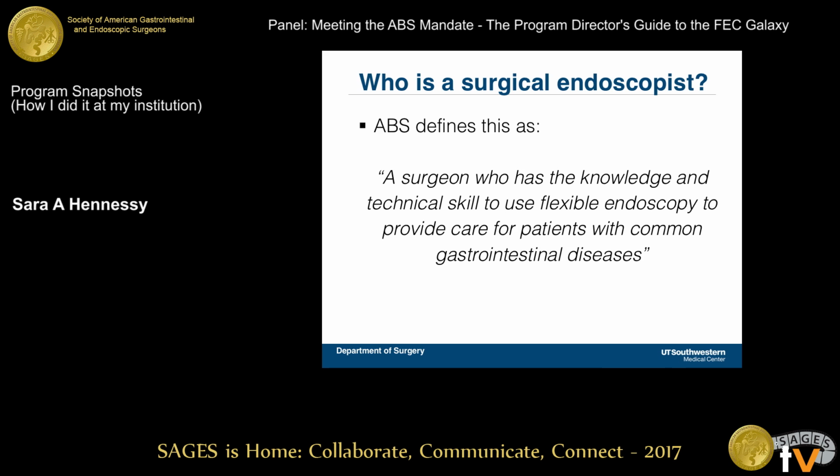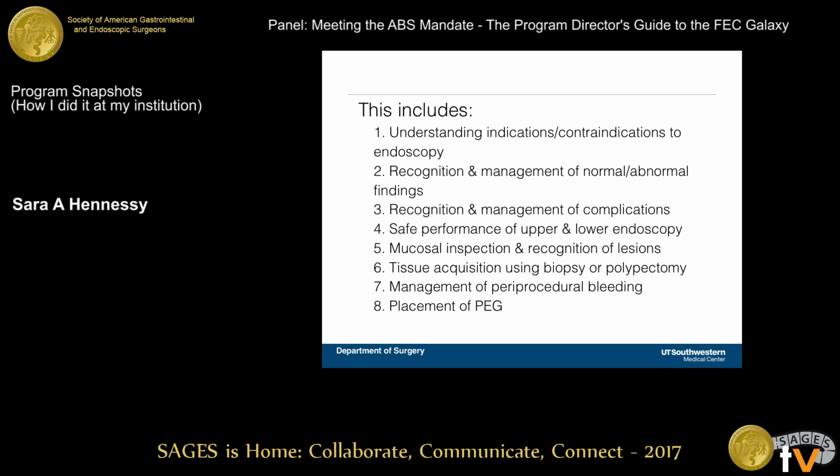So the ABS defines this: a surgical endoscopist is a surgeon who has the knowledge and technical skill to use flexible endoscopy to provide care for patients with common gastrointestinal diseases. This includes an understanding of the indications and contraindications to endoscopy, recognizing and managing normal and abnormal findings, along with the complications that can happen in endoscopy.